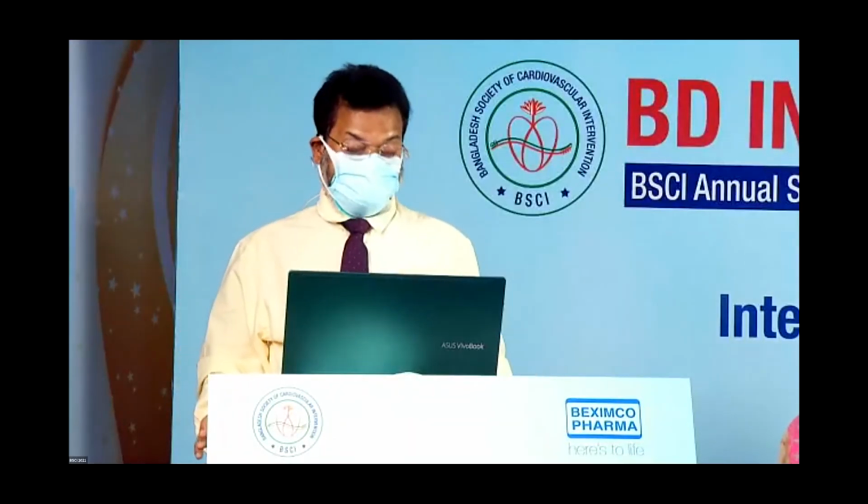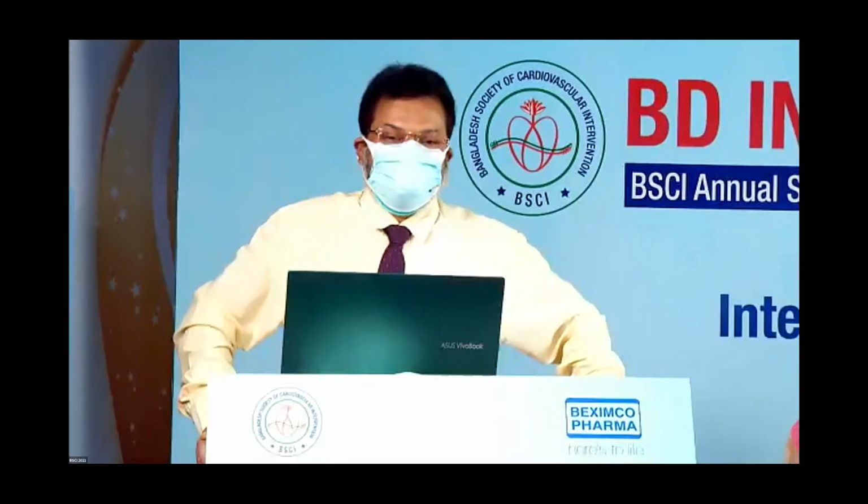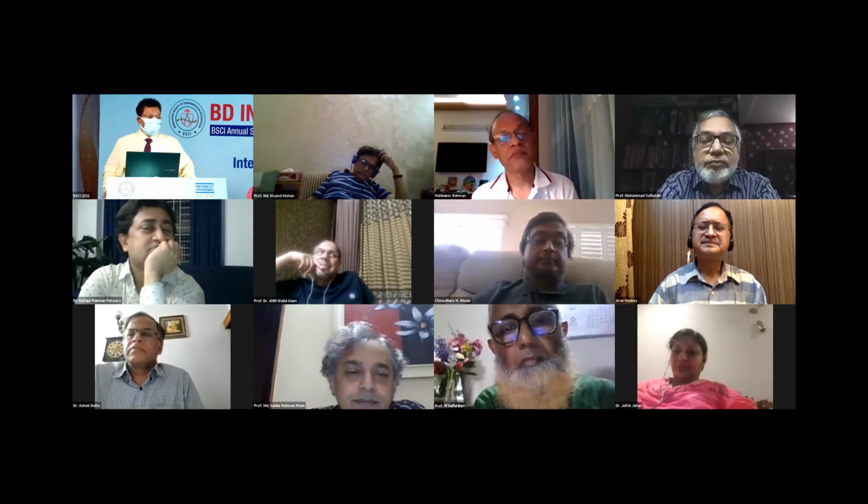We have nothing to do there in the left main. If it is in the distal LAD or the middle LAD, then we can do lots of things there, but it's the left main. So when there is TIMI 3 flow, you should quit as early as possible, even from the hospital, so that you are safe. Thank God, maybe my wires were in situ. If you could not establish flow in the LAD and circumflex, then I would say that with an IABP you send the patient to surgery. That is the last option. Then you have nothing else to do there, and may require emergency CABG.